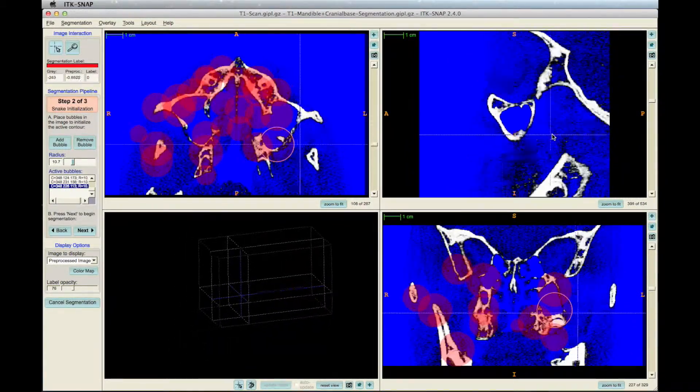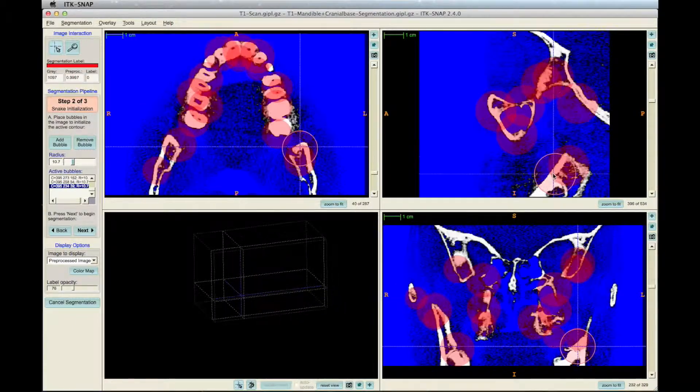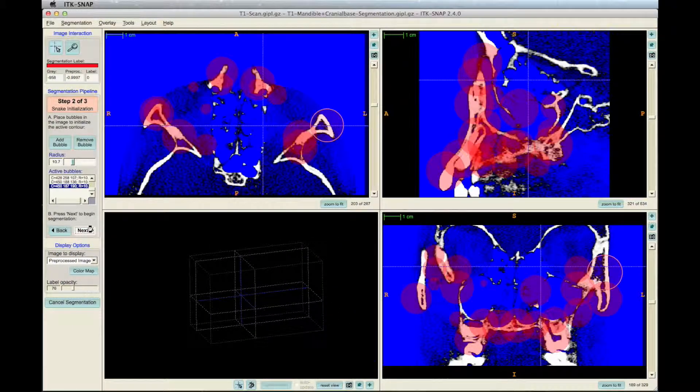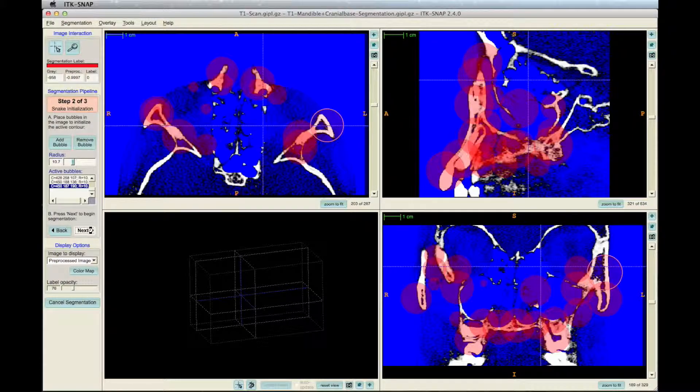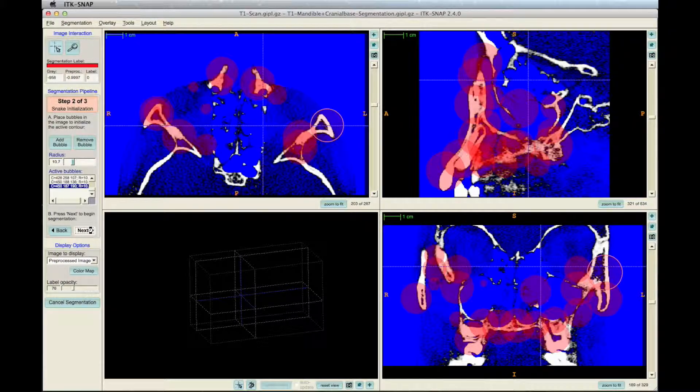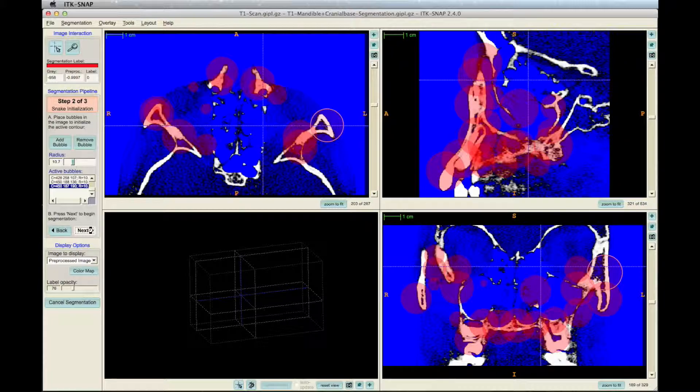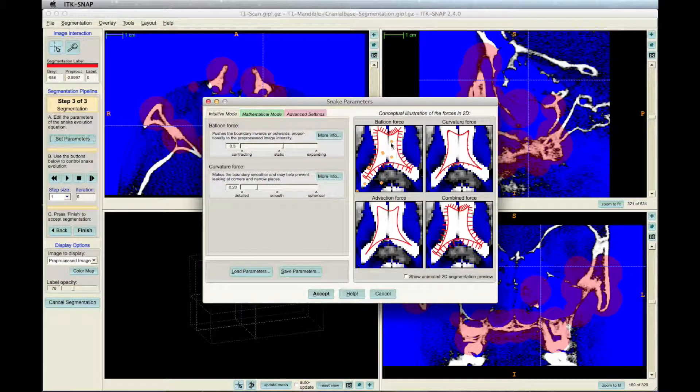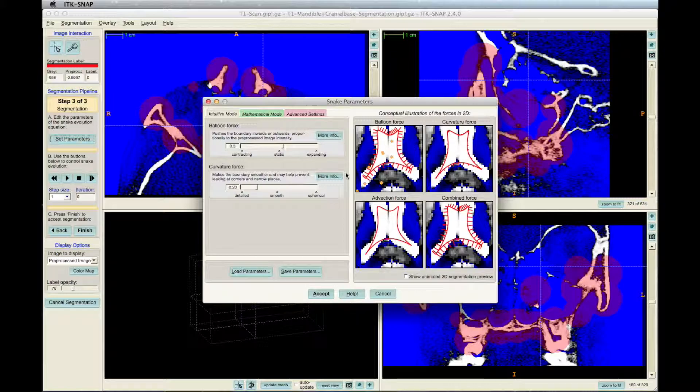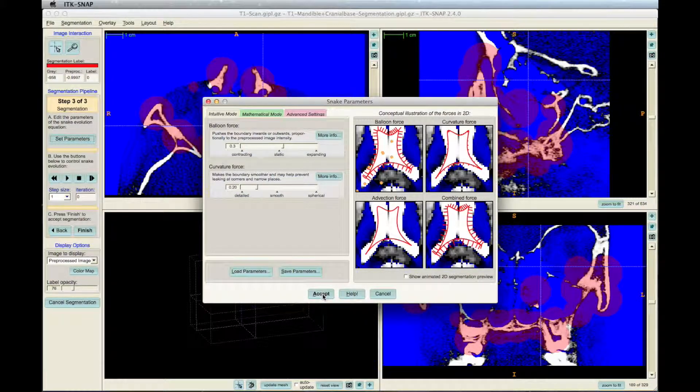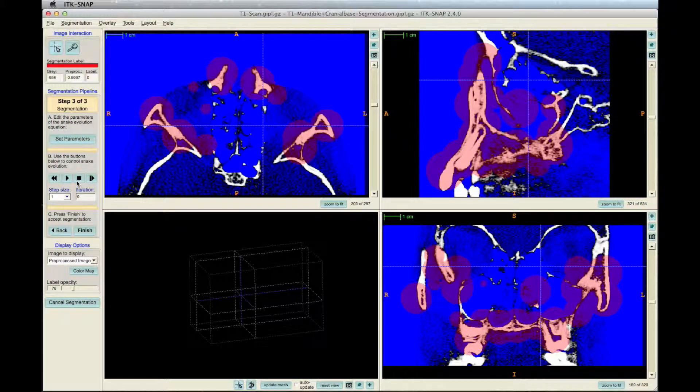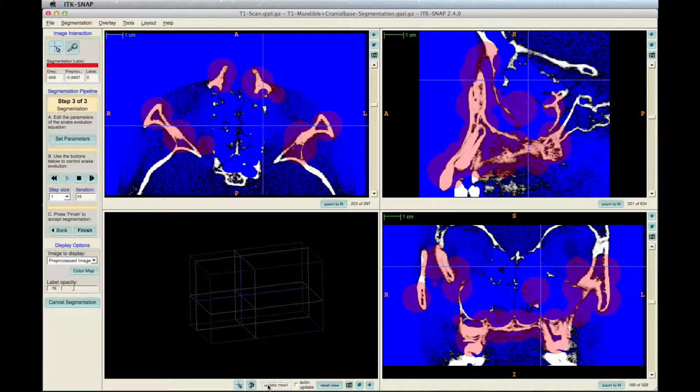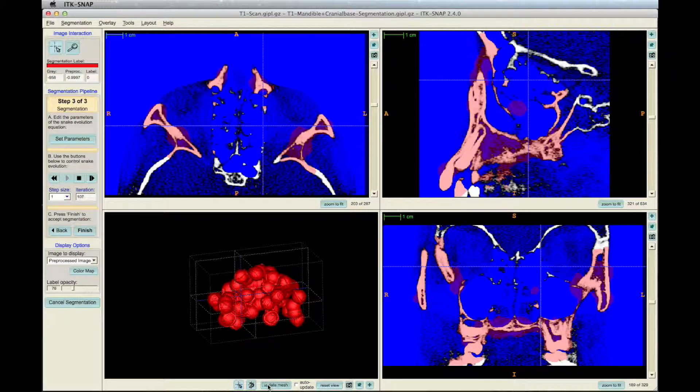When you've finished with the bubbles, click the Next button on the left toolbar to begin segmentation. Next step is the bubble shaping. Click Set Parameters in the right window. Modify the red lines so that they stay inside the white part. Click Accept, then press the Play button on the left toolbar, which runs the program, or makes the bubbles shape only to the white bone.